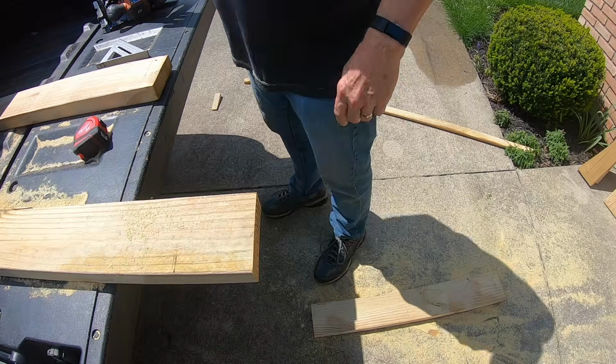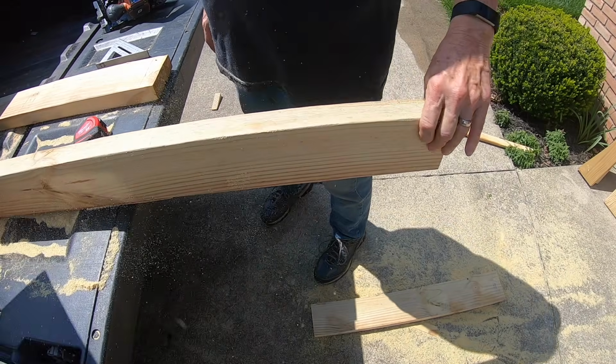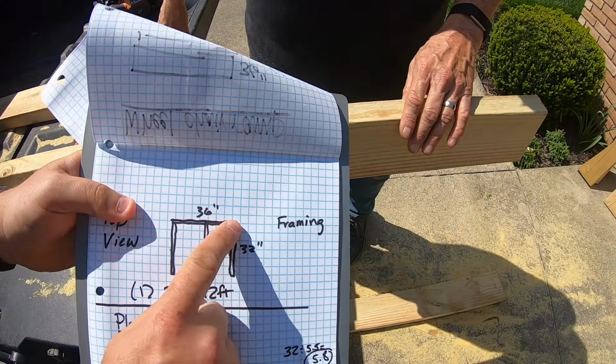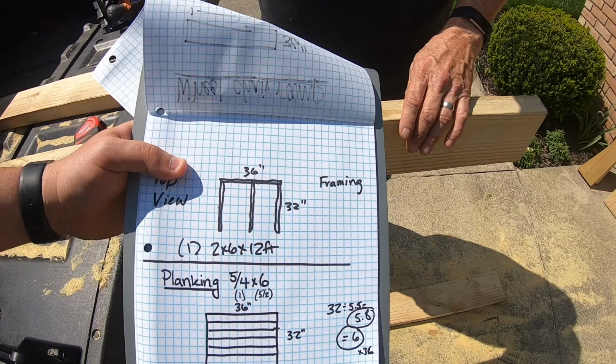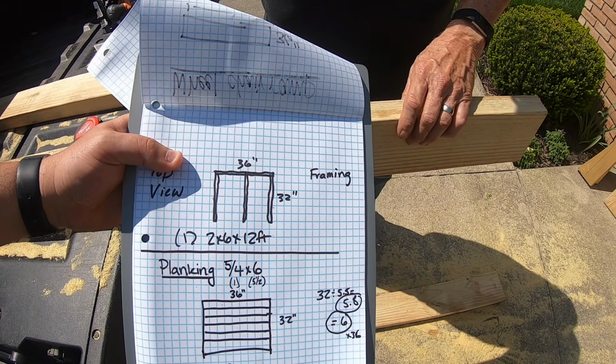And so that is one of your runners. You're gonna need another 2 for a total of 3 runners on this. As we remember, we were wanting to have 3 runners at 32 inches, and then the one big header at 36 inches, which we already did, and we put the little marks so we know exactly where that's at.